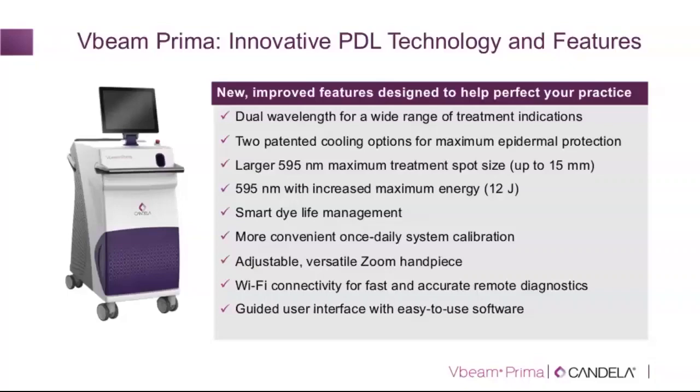There, some questions are duplicates, but there is a question about contact cooling and when to use contact cooling. Now, there are doctors who are used to devices with contact cooling, and they feel very comfortable using that method of cooling. And if that is the case, then you can, of course, use the contact cooling for all the indications with the Vbeam Prima.